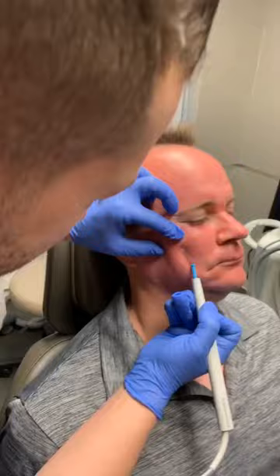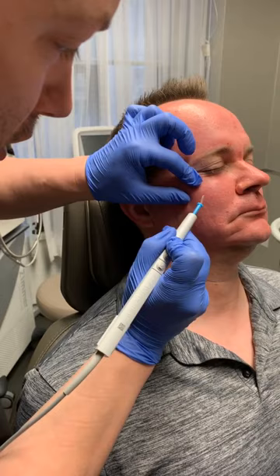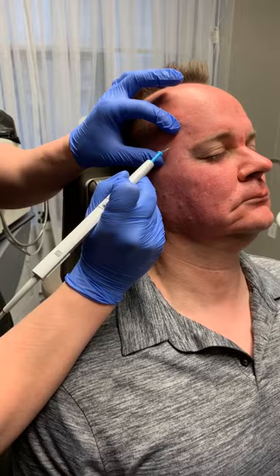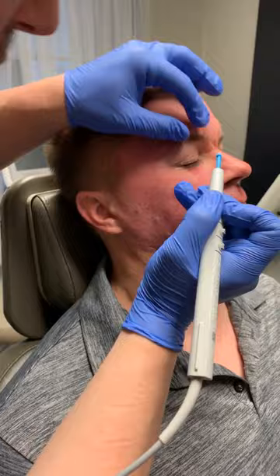Once you burn the base of them, you'll have a little bit of redness here for three weeks afterwards, but you no longer will have the ugly mole. When we're looking around here, there's another one right here. That one's perfect — that one above his eyes, so it's peeling that one.